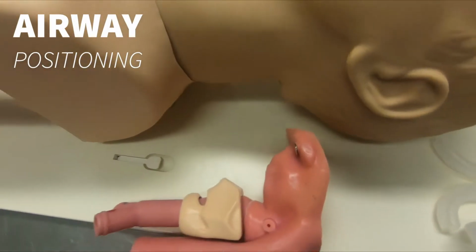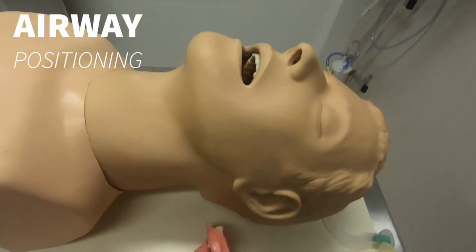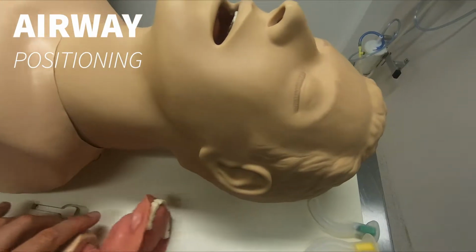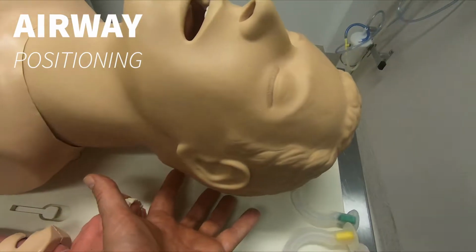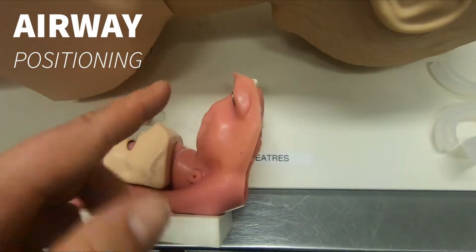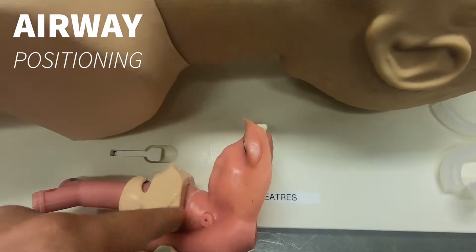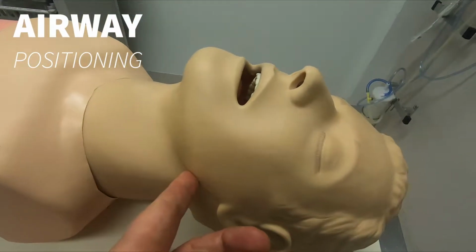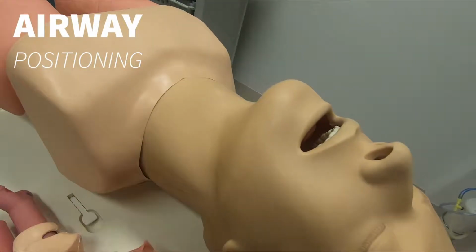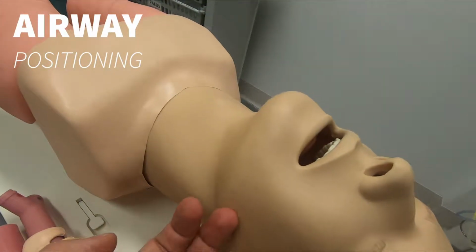So the sniffing position on this model is a bit hard, but it could be accomplished, for example, by putting a cushion or a prefabricated foam cushion structure underneath the head, literally lifting this up, lifting that up, and then smoothing out this sharp bend. Similarly, when we do a jaw thrust, what we really try to do is have this mandible on a straight angle with the bed or the floor, and then we want to lift this up.